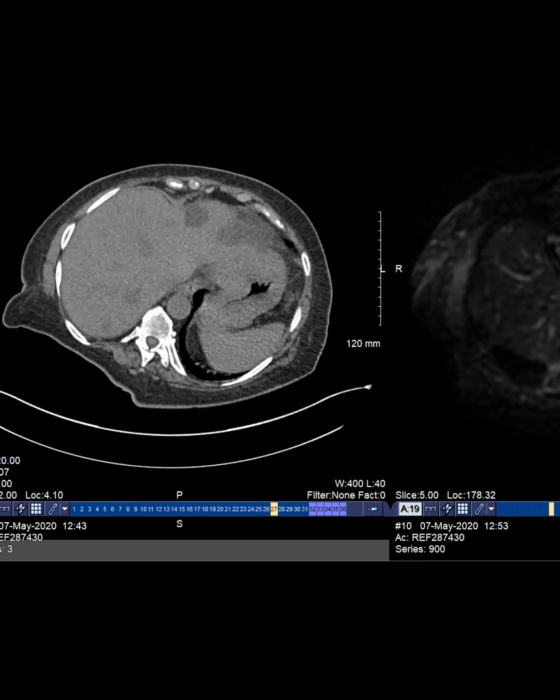All right, these are my two cases. Anu, what did the renal mass turn out to be? So she was lost to follow-up subsequently, and I don't have any follow-up on that renal mass. Yeah. Okay. This is also a problem in polycystic kidneys when there are so many cysts and you're supposed to be looking for masses in between those cyst-laden kidneys. Right. Diffusions are a super helpful tool, I think. Thank you, Anu.